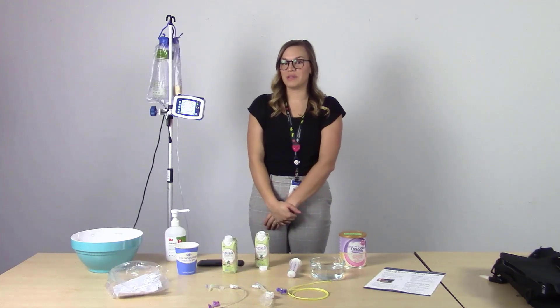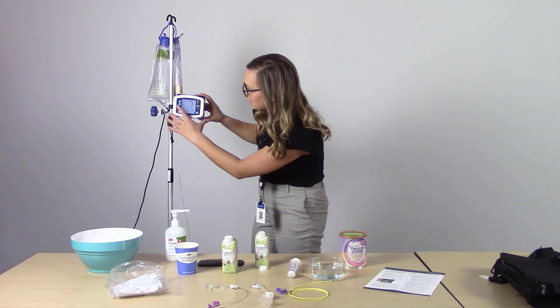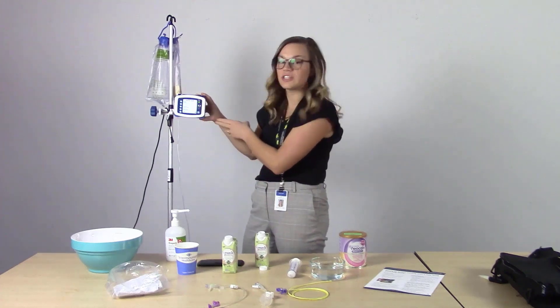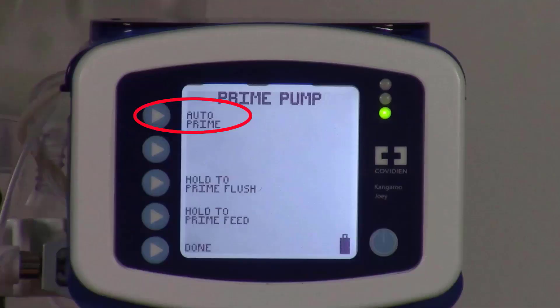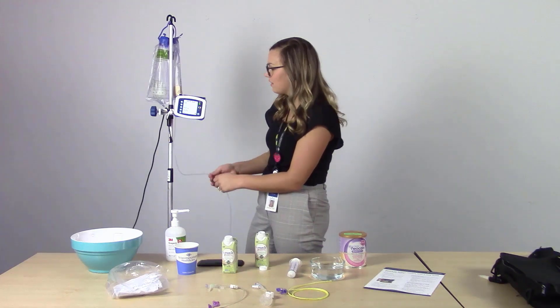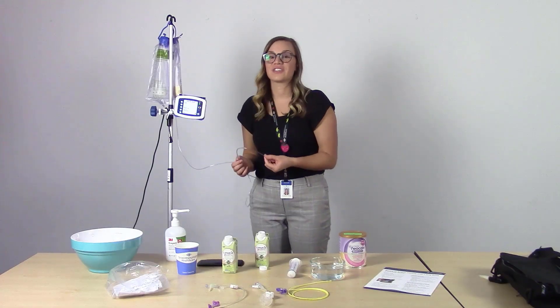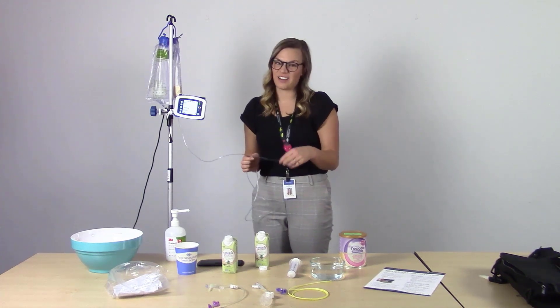Next, we will prime the tubing by selecting prime pump. On the screen, there are a couple of different options. First, it will say auto prime, which means the pump will automatically push the water and formula through the tubing to make sure there's no air in the line. We want to prime to make sure there's no air getting into the stomach, which would cause bloating or abdominal discomfort.